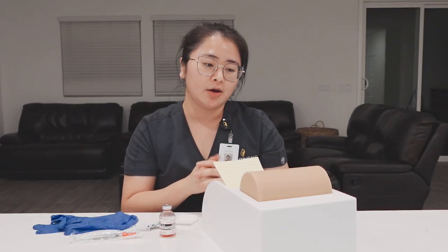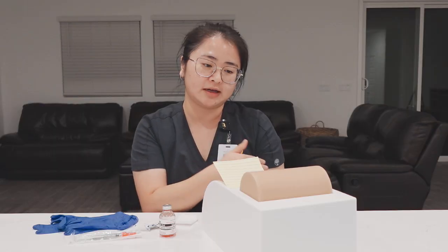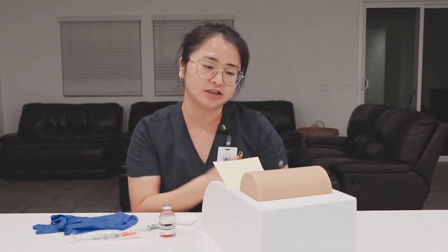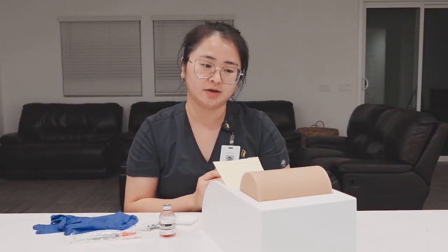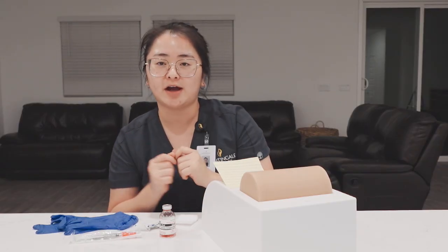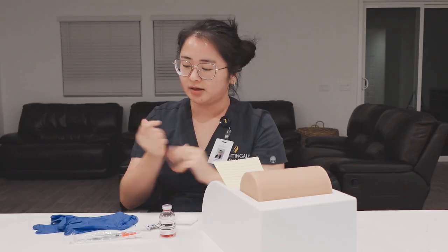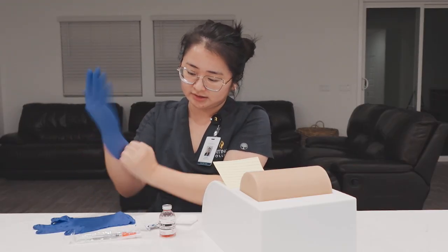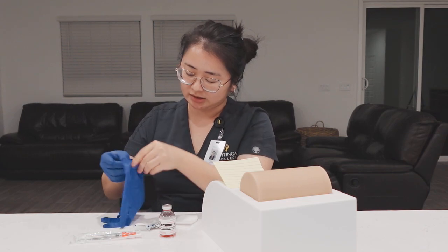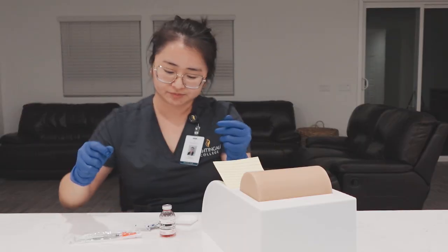On a different note, when I give you the injection, you may feel a slight stinging or burning sensation. That is normal. Do you have any questions, comments, or concerns? No? Perfect. Give me a second, okay? This is where I verify the medication against the MAR for a 3rd time. I'm going to perform hand hygiene and don my gloves. Also, Mr. Smith, you are able to ask any questions anytime if you are confused.